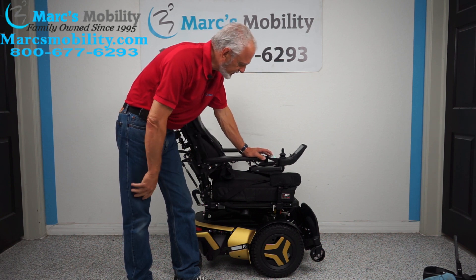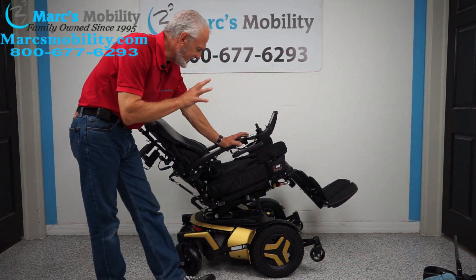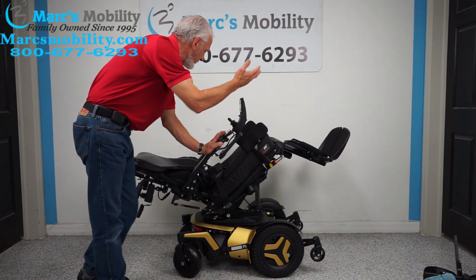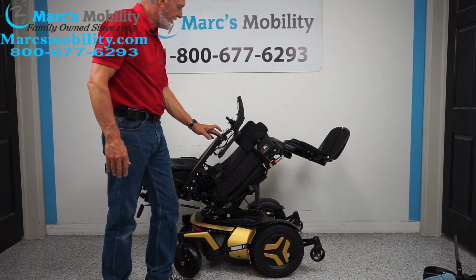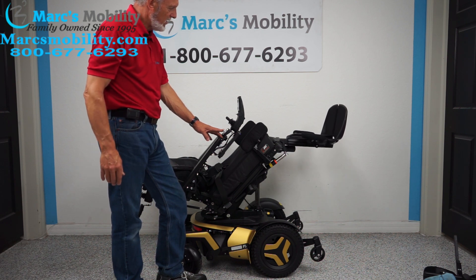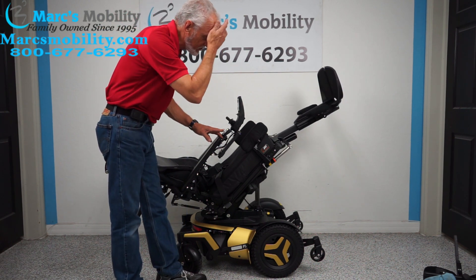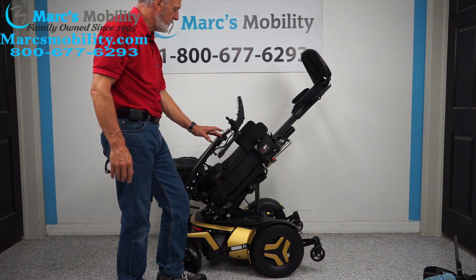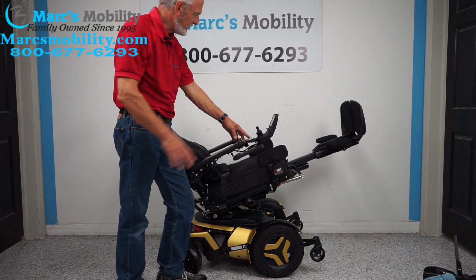The next feature is the electric tilt. The electric tilt is when the base here goes back — the legs and the back go back together because they're all connected. This is good if you want to relieve pressure off your bottom or back, just want to relax, or want to have your legs up in the air. Now with the seat tilted back, I'm going to show you the feet — the legs going up. This is if you need circulation; I'll show you the extreme position.